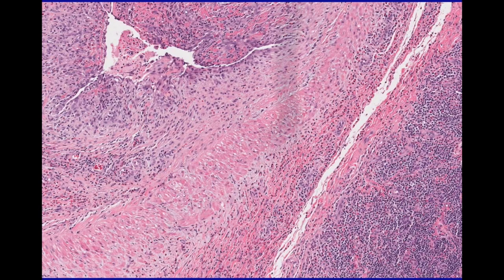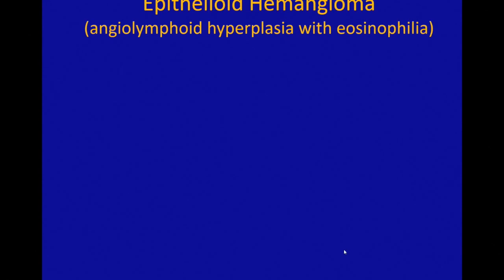Here's the vessel wall, and here's the kind of proliferation within the vessel and then extending outside the vessel. So the term I like to use is epithelioid hemangioma. In dermatopathology we often call it ALHE, for angiolymphoid hyperplasia with eosinophilia.